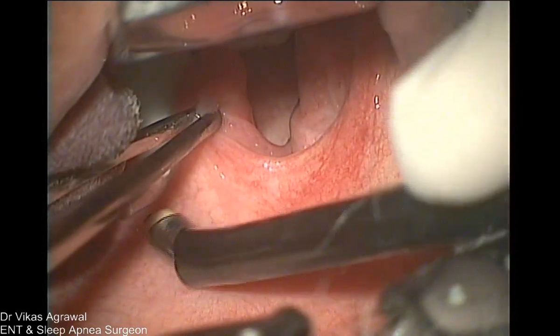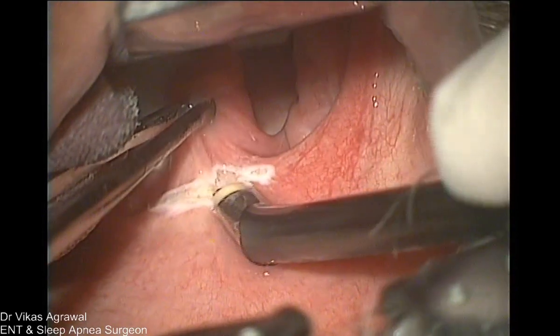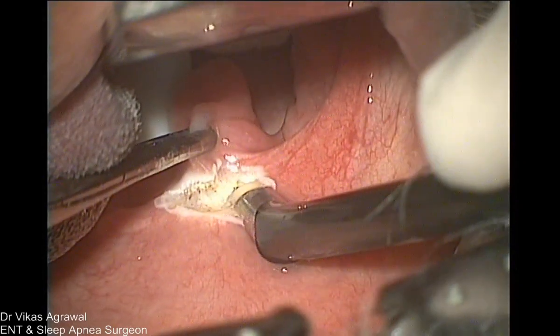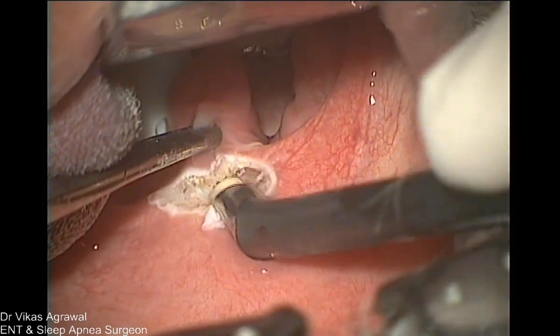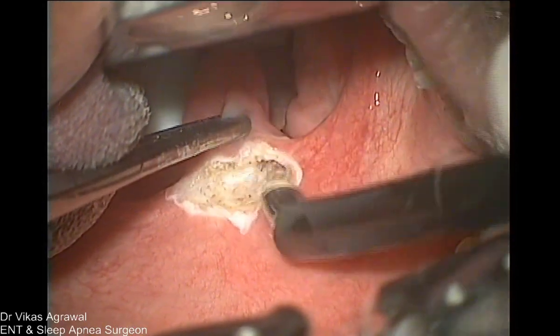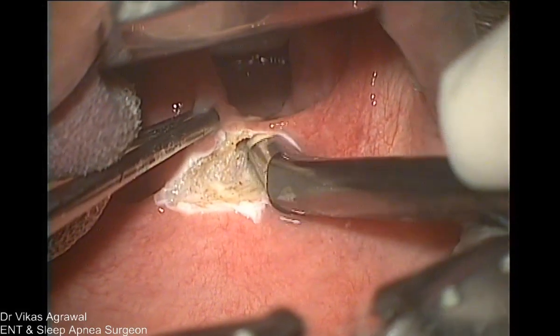This is the anterior pillar, this is the anterior pillar. So I'll go anterior pillar to anterior pillar again. Now since we are not using laser, even if it touches here, doesn't matter. There is no thermal impact.